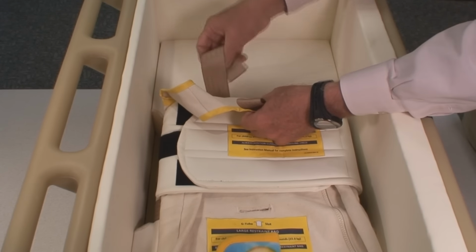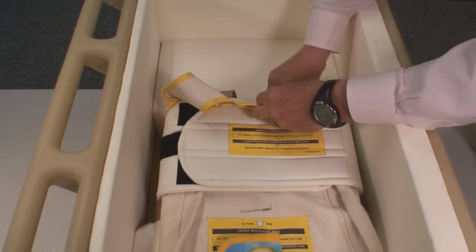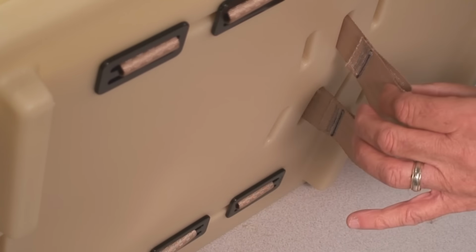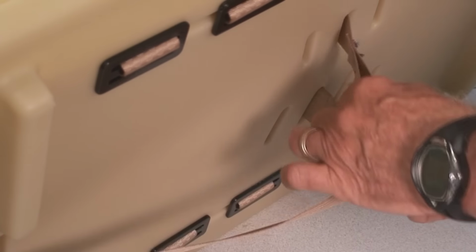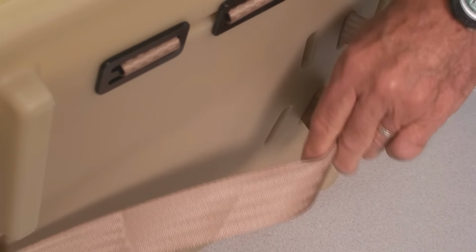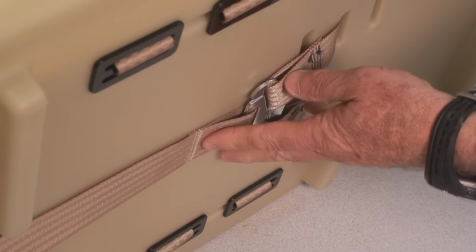To install the restraint bag, you put the loop through the slot and push it all the way through. One side, and the second side. Now you're ready to pull the loop through the back of the slot. We now have the shoulder straps through the slots in the bottom of the base, and we're going to connect the metal splitter plate to the straps. Once you have the straps connected, you pull the A-lock strap tight, and now you have a good install.